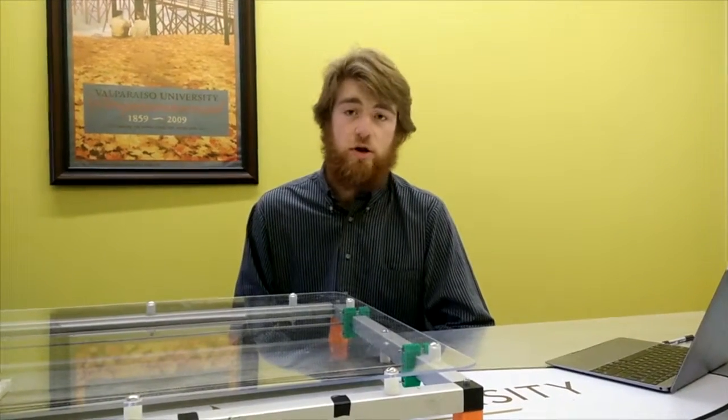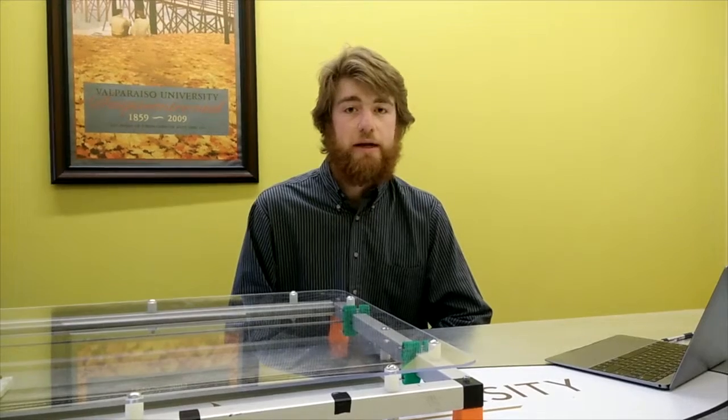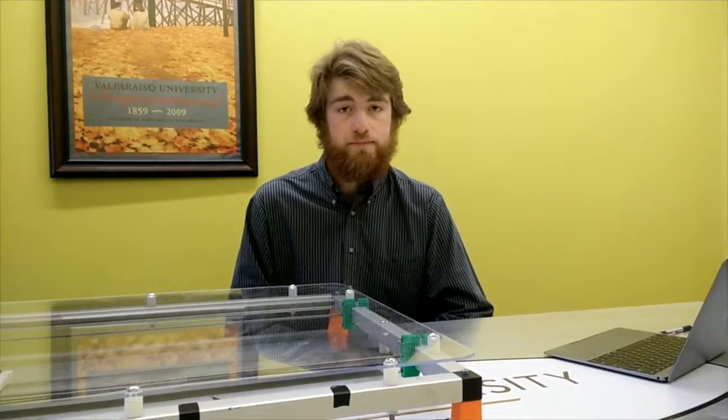We are the Light Energy Visualizer team. For our project, our goal was to measure the amount of light energy hitting infants during phototherapy.